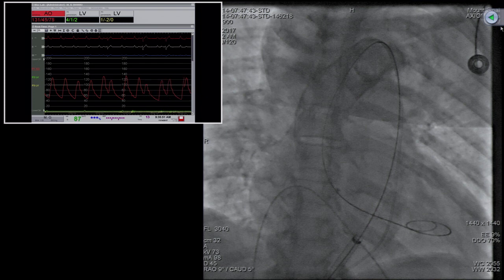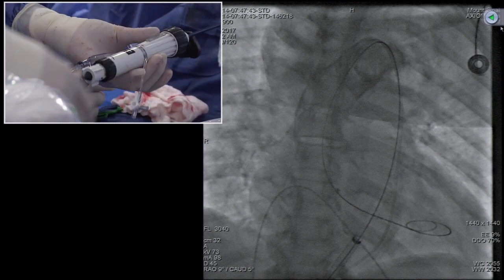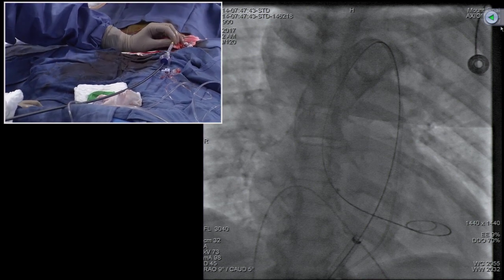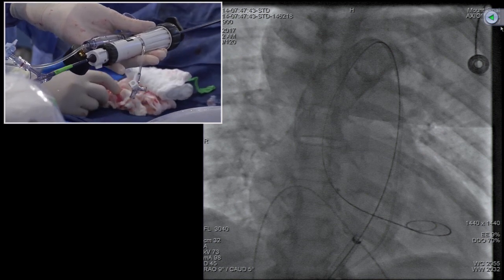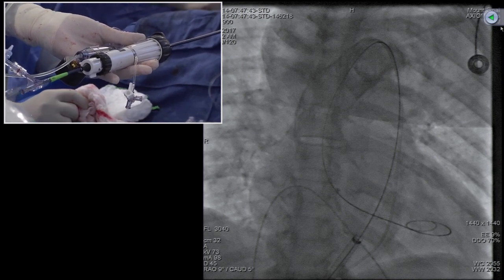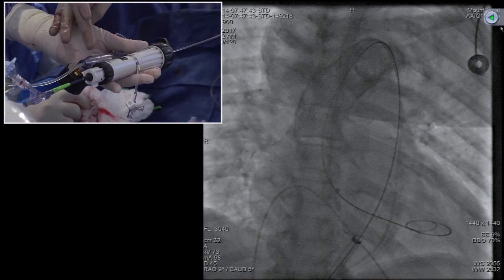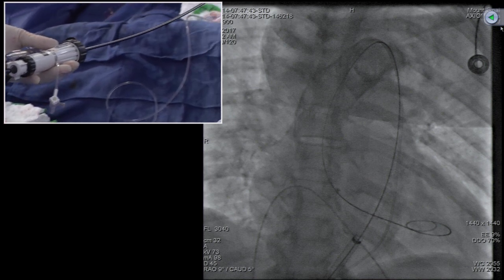Yes, Sapien 23. If you see here, this essentially includes a balloon catheter, which is inside the flex catheter. The flex catheter will take the balloon with the valve that's crimped on the balloon through the aorta up to the aortic valve. And this is the large wheel which helps the flex catheter to be flexing. Very important in this particular case to do the no-touch technique, that when you are going across the aortic arch, you're flexing, so the valve will be in the center of the aorta, not touching the wall. And then you have the fine adjustment wheel and the lock that locks on and off the balloon, which essentially carries the valve. Okay, let's carry on now.